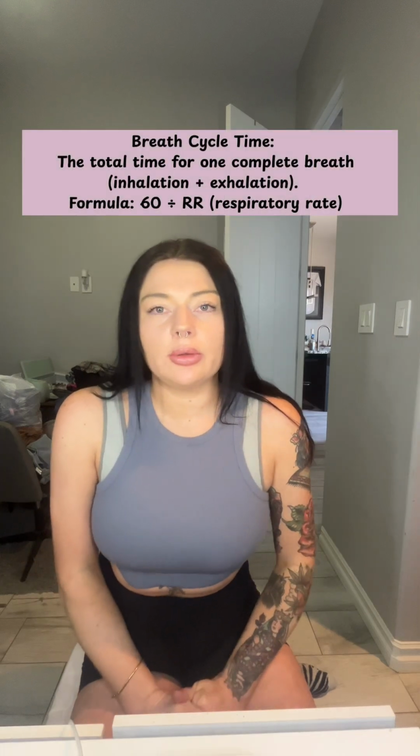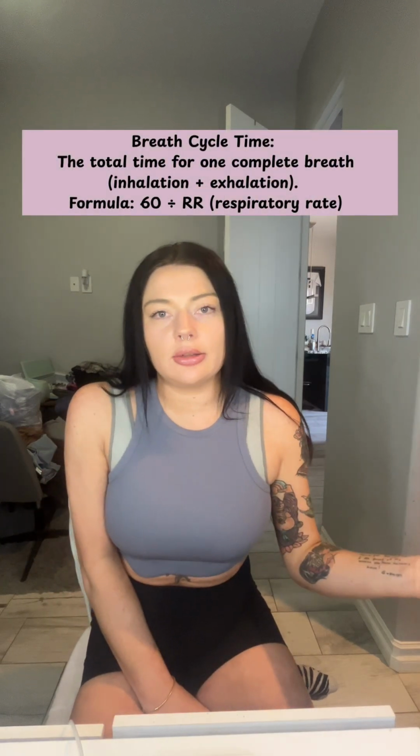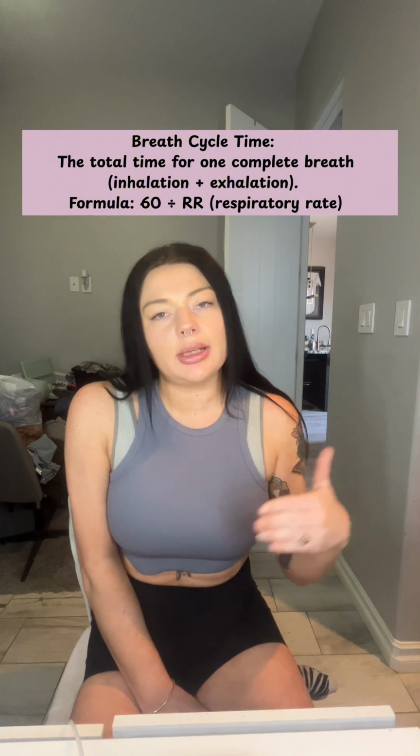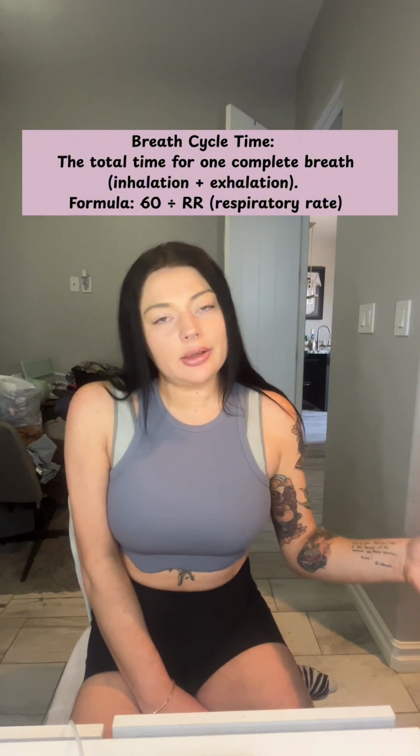Breath cycle time is the total time for inhalation and exhalation for one breath. It determines how much time you have to split between inspiration and expiration. If you want an equation, you can do 60 divided by your set respiratory rate, and that will give you seconds. So let's say 60 divided by 20 equals 3. For one single breath, you're going to have 3 seconds for inhalation and exhalation. Whereas if you're on a higher rate, you're going to have a shorter total time for each breath.